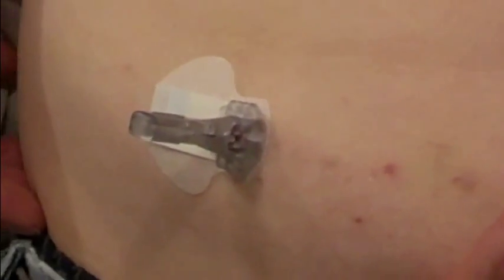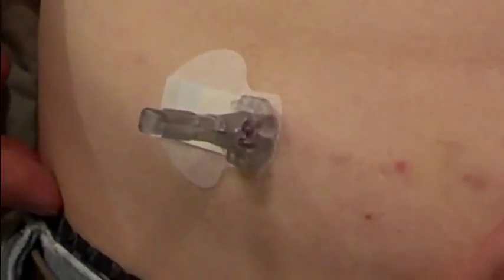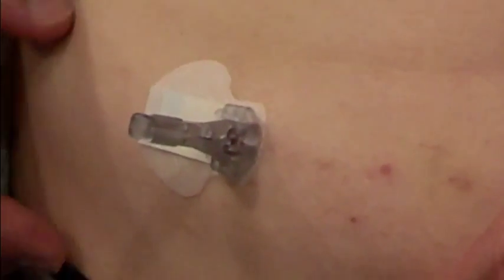This is Neil Moncrief. This is December 29th, 2013, and I'm having problems with the continuous glucose monitor.